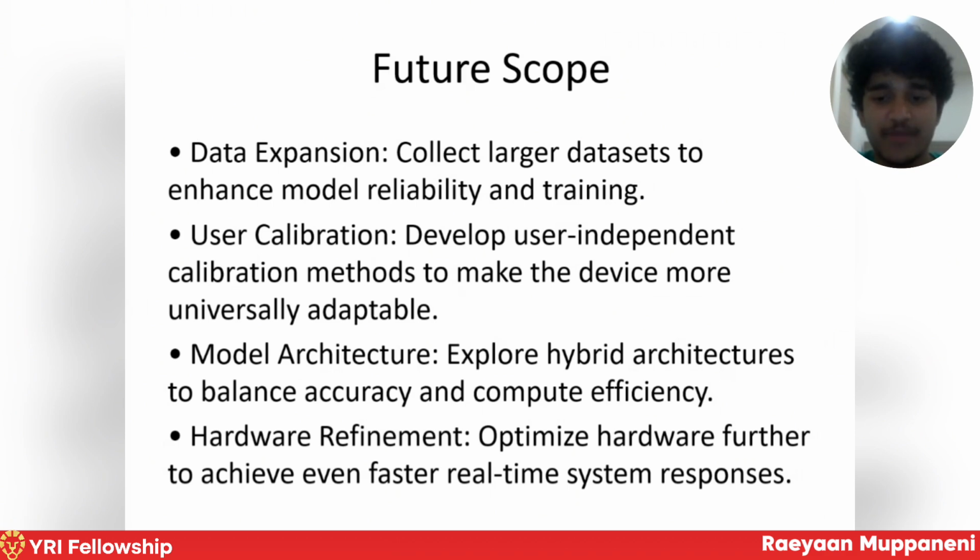Additionally, for hardware refinement, you could optimize the hardware. And in terms of the hardware, I'm talking about the actual robotic arm here. Generally, you want a robotic arm that uses energy conservatively, efficiently. That way, the cost is also minimized. Additionally, you want a prosthetic or real robotic arm to avoid jerky motion. So these are things that can be optimized to provide the ideal prosthetic.